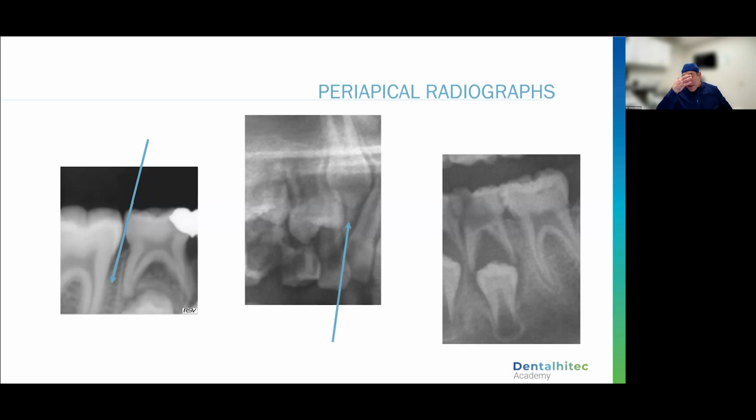Canines sometimes are an area, especially if they have ectopic permanent cuspids, you may have issues with root proximity or location of that permanent cuspid in the area you want to give your local. So you may need to choose either mesial of tooth number C there or distal of tooth number C, but look for bone. If you find that you've got issues with root proximity, you can also give it palatally. It's a little harder to see, of course, in the anterior, but most of the time, if I'm extracting primary canines, I'm going distal to those primary canines.